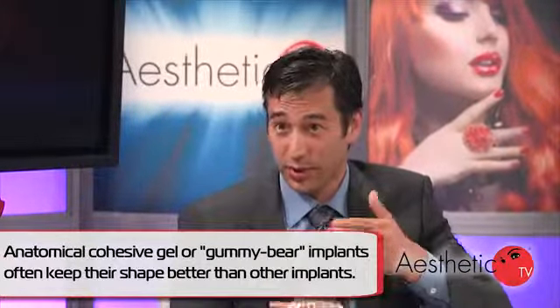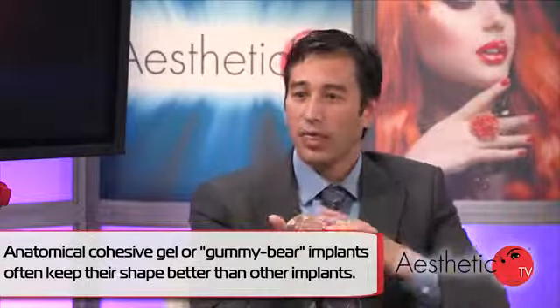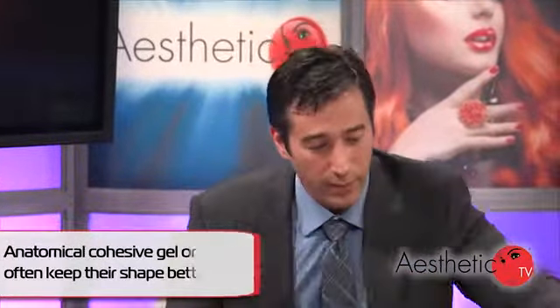But now we have these shaped implants. They're anatomical, meaning if I hold this thing up like this, you can see it naturally has a flat spot here and it's full. These are shaped like that no matter what position you're holding them in. Unfortunately, I don't have a good example today to show you, but literally they're shaped like this all the time. The nice thing about that is if you have a patient who has almost no breast tissue and wants to be a large-breasted person afterwards, if you put that in, it'll actually have that natural shape. The round is less likely to give a natural shape.